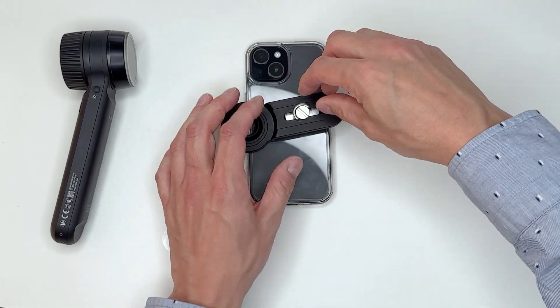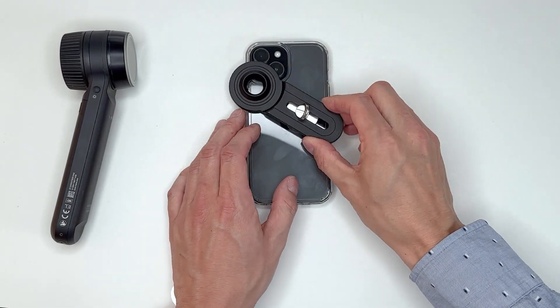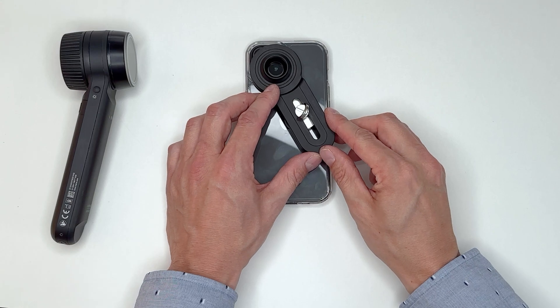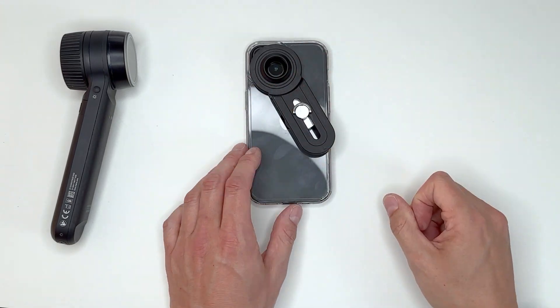Magnetically connect the handle to the fixing button and loosen the screw slightly to adjust the handle to the position of the smartphone camera. Tighten the screw once it is in the desired position.